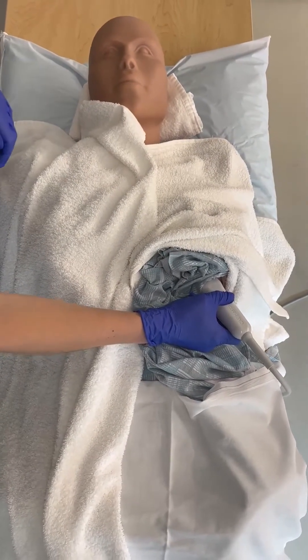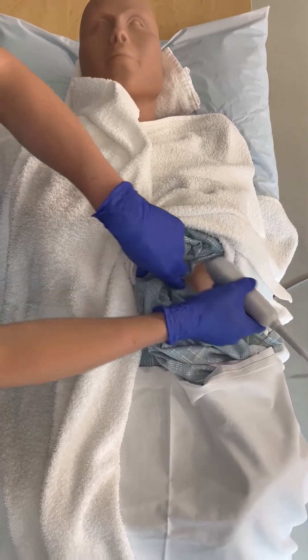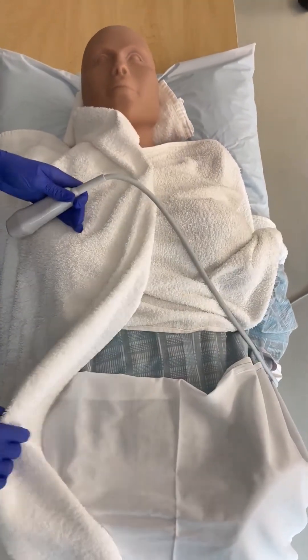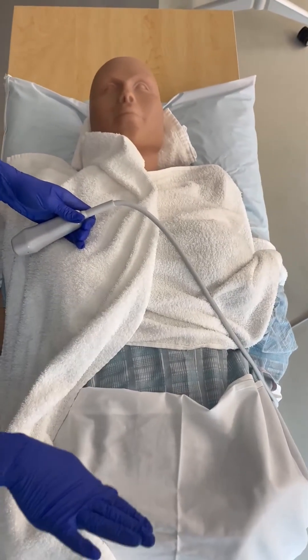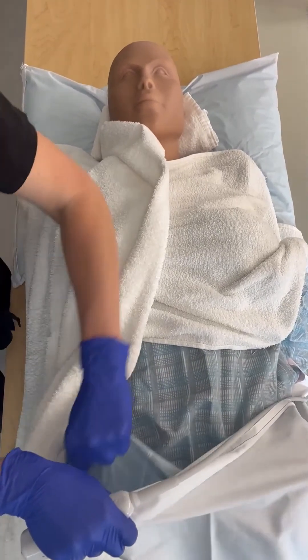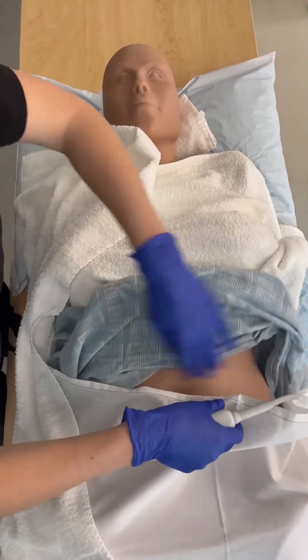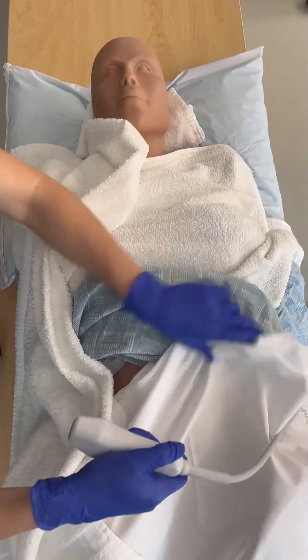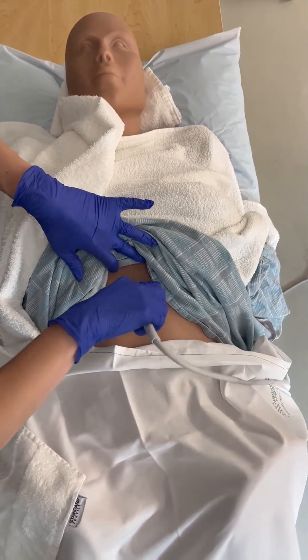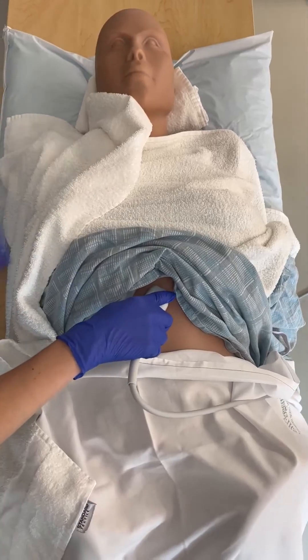Check in and ask, 'Are you comfortable with how I have my hands?' Then go ahead and do the apical four chamber view. Lastly, we're going to do the sub-xiphoid view. It's helpful to have a sheet covering the patient's bottom half. Lift the gown, use the sheet to keep their abdomen and lower half covered, and position the probe with the probe marker pointed towards the patient's right, just under the xiphoid process, to get the sub-xiphoid view — and again, keep the patient covered.